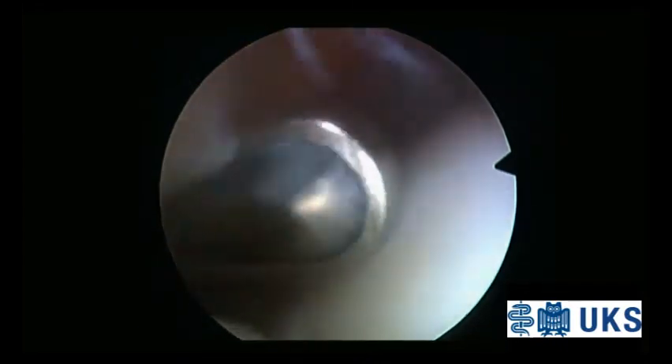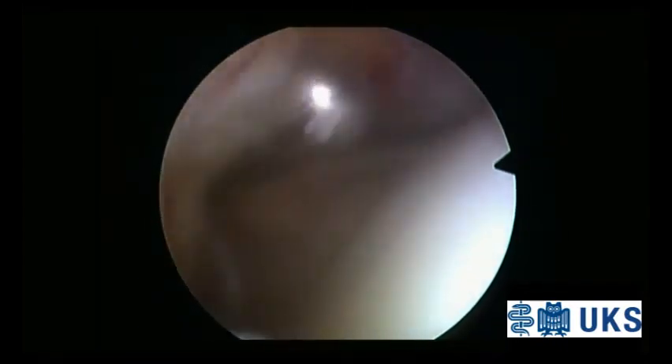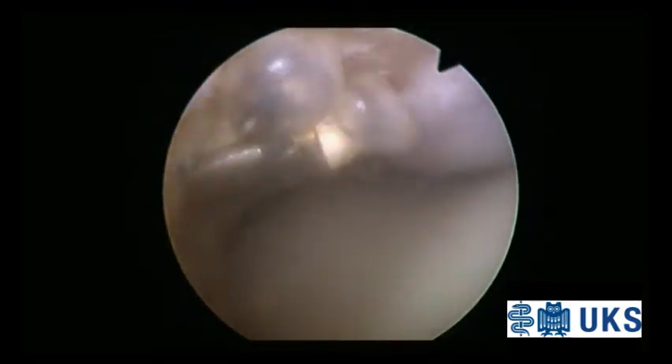This is a scope video presenting the important steps of the surgical technique for arthroscopic treatment of chronic patellar tendinosis. In this case the patient is a 22-year-old athlete, a soccer player suffering from jumper's knee. The left knee is affected.